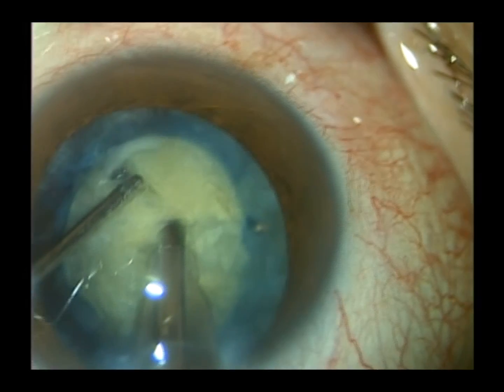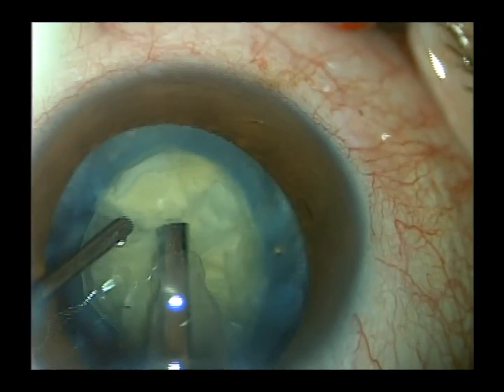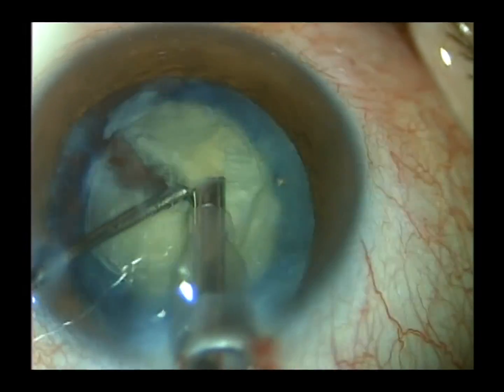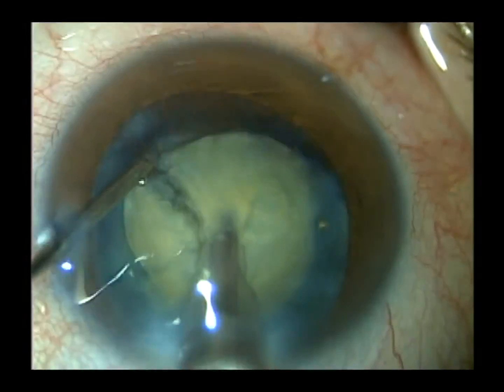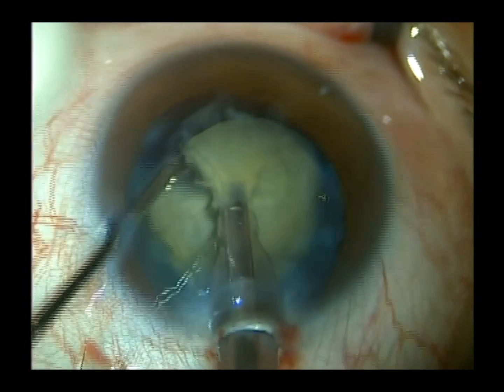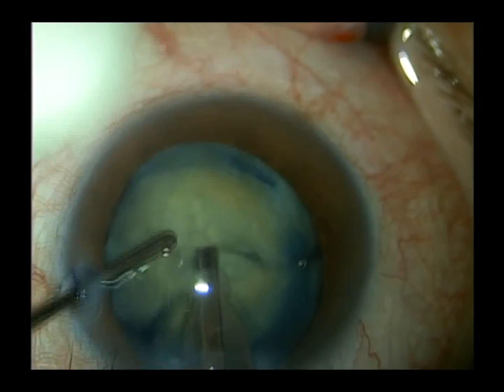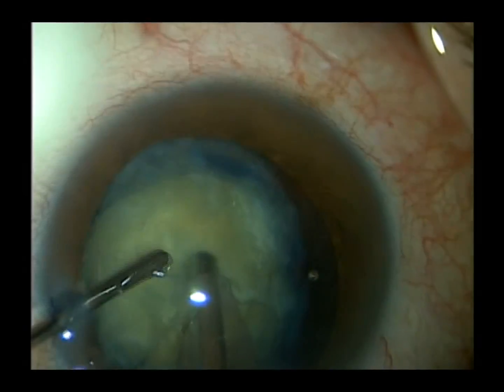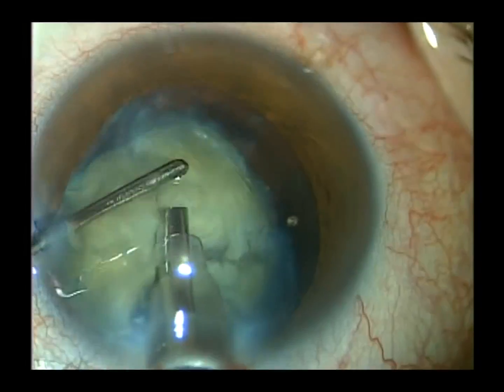As we work on this lens, we find it's actually a hypermature cataract where the cortex is mainly liquid-like and the nucleus is almost floating in this liquid-like white cortex. The Ellipse FX handpiece with the AMO system works very well on dense cataracts. We boosted the power here to 90 to 100%, up from our usual 40% which is what we use for almost all other cataracts.